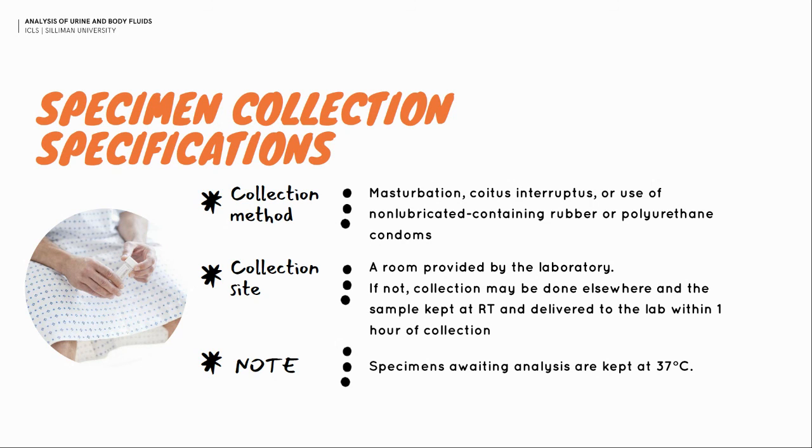Now, for the collection site, it is a room provided by the laboratory. I have not encountered it so far, but I think it is usually the comfort room of the laboratory. Some patients collect at their own home, or the patient is admitted. And if it is not in the room provided by the laboratory, the sample should be kept at room temperature and delivered to the laboratory within 1 hour of collection.